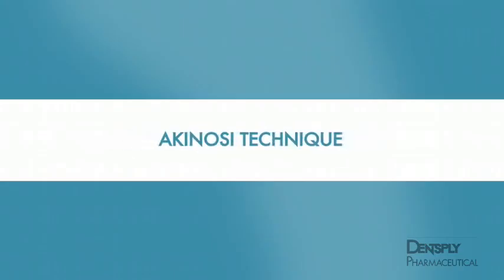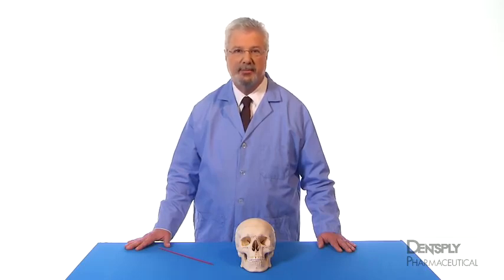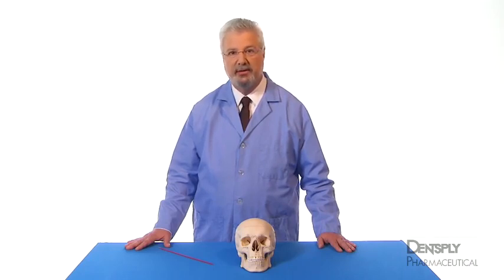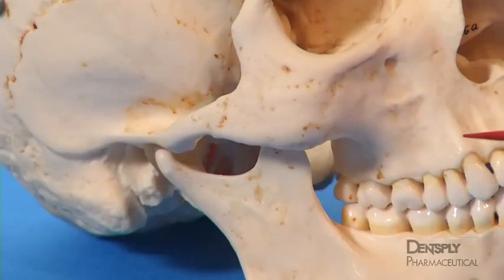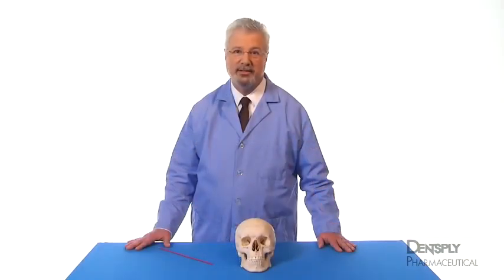Akinosi technique. The closed-mouth approach to mandibular anesthesia, or Akinosi technique, uses the cleft between the ramus and the maxilla in order to access the pterygomandibular space. Although the target for injection is not well identified, there being no bony contact to indicate proper insertion depth, the needle ends up in the pterygomandibular space somewhat superior and medial to the standard inferior alveolar nerve block. The extent of intraoral anesthesia is similar to that of the Gow-Gates block.